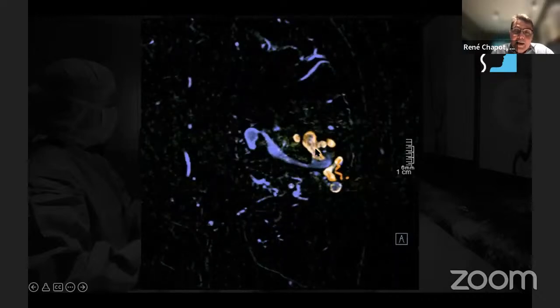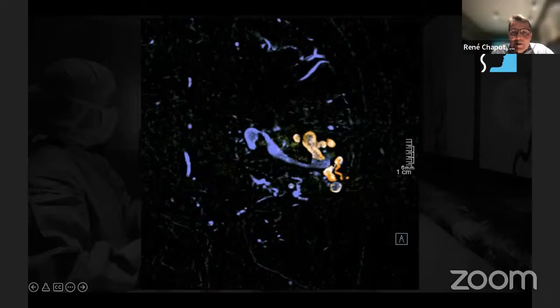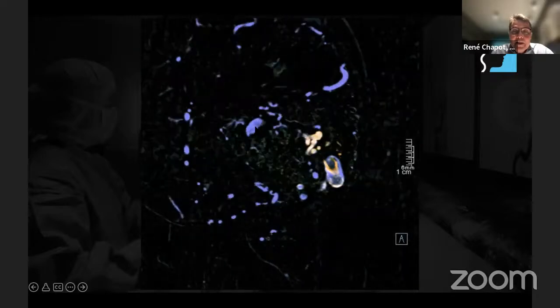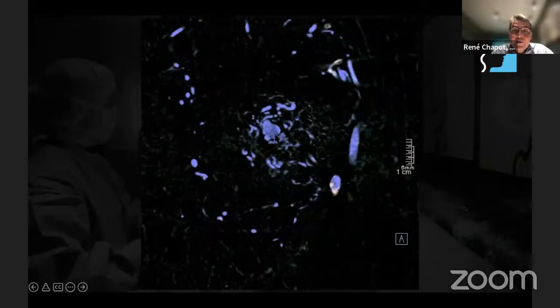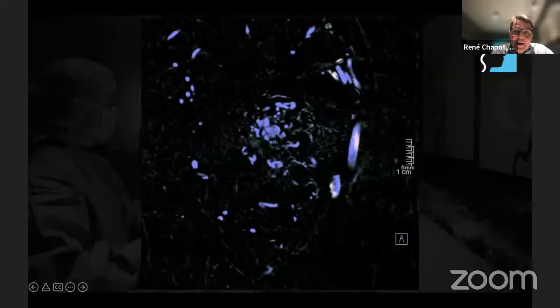I'll go back. Here, before, you see that vein, which is coming from here and getting up to this part. So this is distal in the course. And if I follow this vein here, I can see that this vein is now arriving at all the shunts. Here are a lot of arteriovenous shunts. So if I go back again, we follow the shunts.